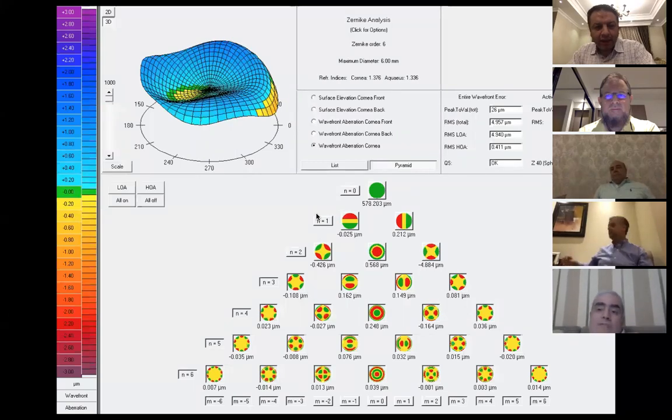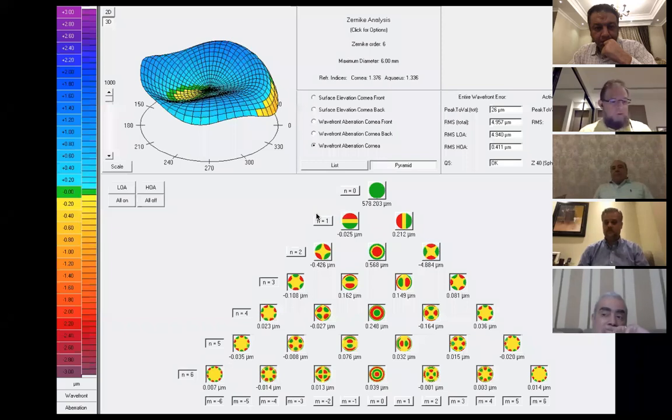But there is a question from Miguel, asking: do you recommend the measurements of higher order aberration at a 4 millimeter pupil zone or at a 6 millimeter optical zone? I think the one who is asking means ocular wavefront, because ocular wavefront is affected by pupil, but the corneal wavefront is not.